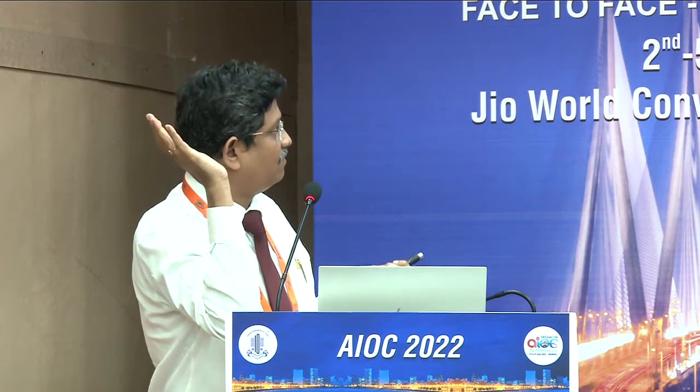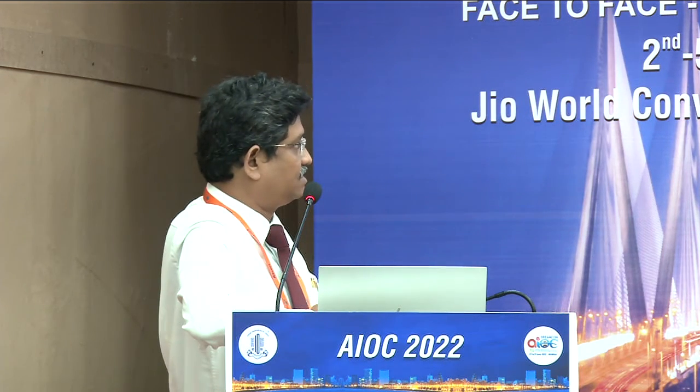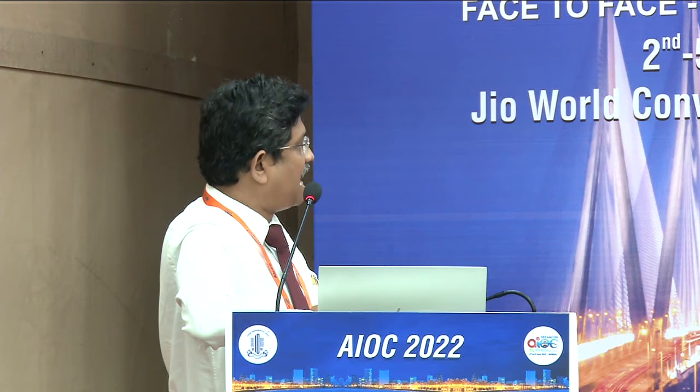And then the donor site has been lasered successfully, and the rest of the fluid has been taken out. Now, yes, you have done the surgery successfully. Now, whether the retina has been closed, or the hole has been closed properly? Yes, this is the success rate you can see. Earlier I showed this was a scar tissue, but here the retinal architecture is somewhat similar to the other part of the retina.